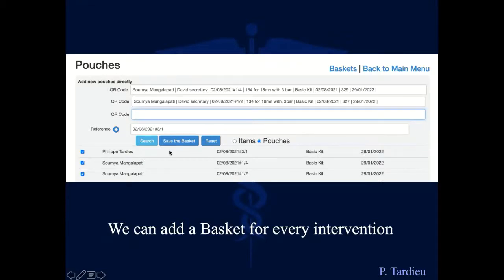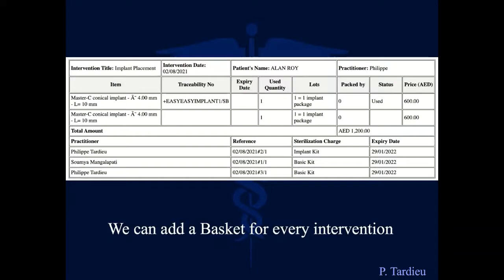Saving the basket is just showing that you've been using these instruments sterilized on this sterilizer at this date by this responsible personnel following this process and all going to this patient and this surgery. So now you are working in conformity with local medical authorities. You are showing to the judge that, yes, I have been using these sterile pouches for this patient, this day and this surgery. Okay? So now the work is done, and you are linking the basket to all that.